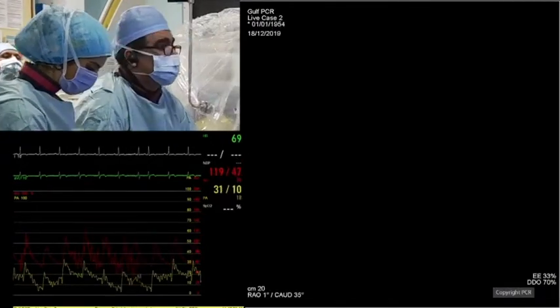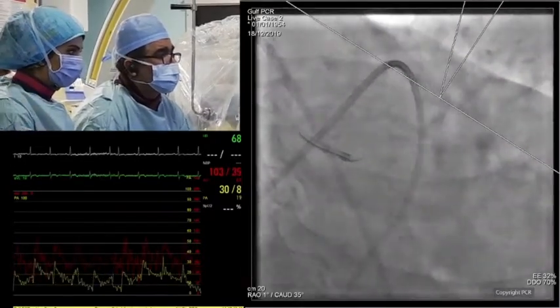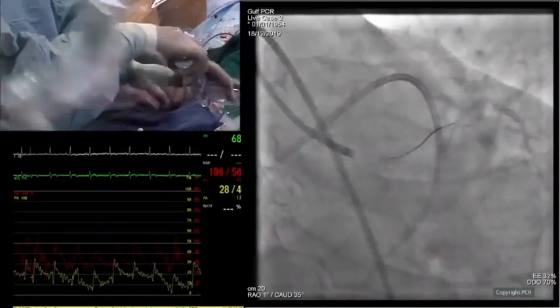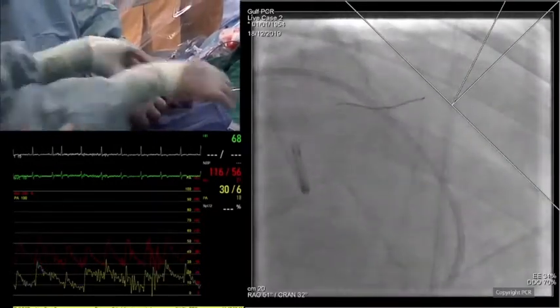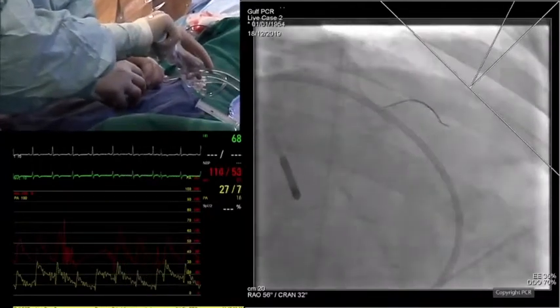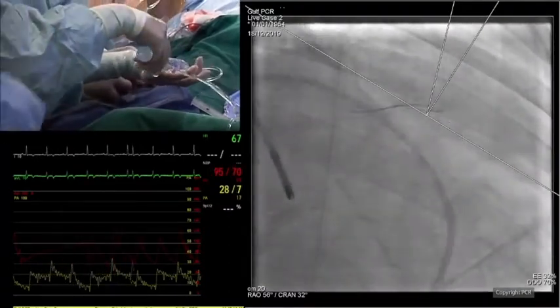But on the other hand, I must say that the value they found in the right coronary artery is close to the cutoff. It is not overtly normal. So my impression is that they are doing the right thing. In a patient like this, there is time later to discuss what to do. I will concentrate on what really matters, which is the LAD, like they are doing. That's basically my comment. And what you can also see when you see people like Hassan and her colleague Shihin is that they do this routinely.